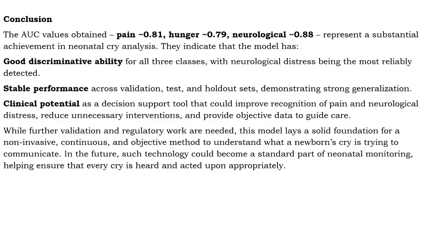While further validation and regulatory work are needed, this model lays a solid foundation for a non-invasive, continuous, objective method to understand what a newborn's cry is trying to communicate. In the future, such technology could become a standard part of neonatal monitoring, helping ensure that every cry is heard and acted upon appropriately.